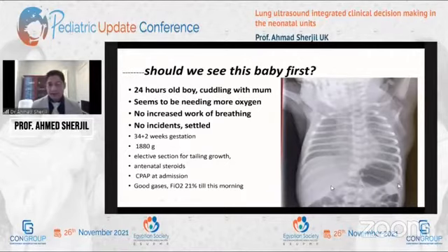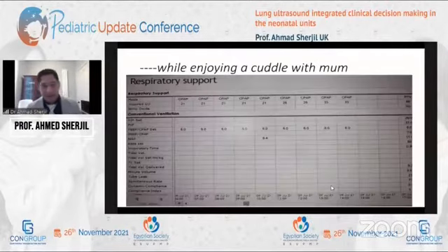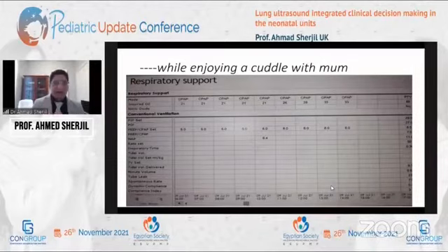Okay, ground glass, streaky, nothing too exciting here, something in keeping with this gestation. This is an original anonymized photograph of the patient's entries. Here you can see where the arrow is, inspired oxygen 21%, and there were no incidents, but it was creeping up. It was 33% when I saw him.